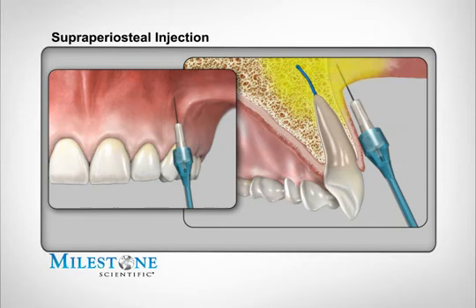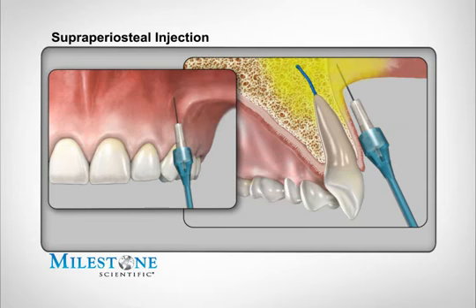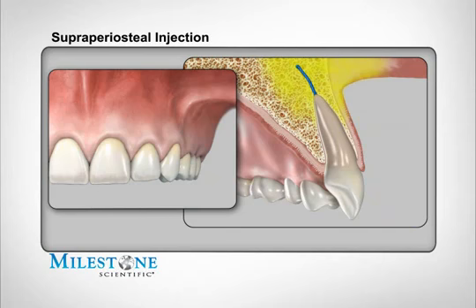To avoid anesthetic solution spray back into your patient's mouth, perform the following. While the needle is still embedded in the patient's tissues, depress and release the foot control pedal. Count 3 beeps after releasing the foot control and then totally remove needle from patient's mouth. Direct the needle away from patient as a small amount of anesthetic solution may still be present. Should you require more than one anesthetic cartridge, you can reload subsequent cartridges and continue as required. Please see the section on multi-cartridge technique.